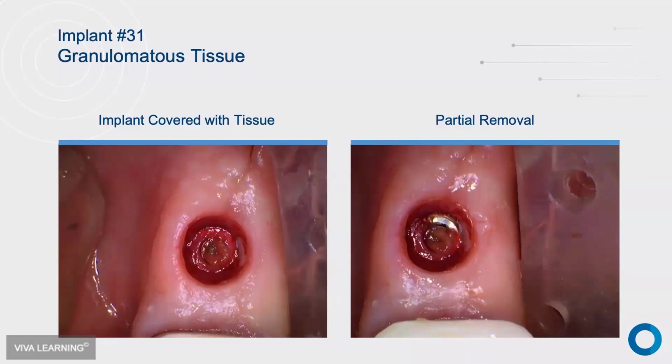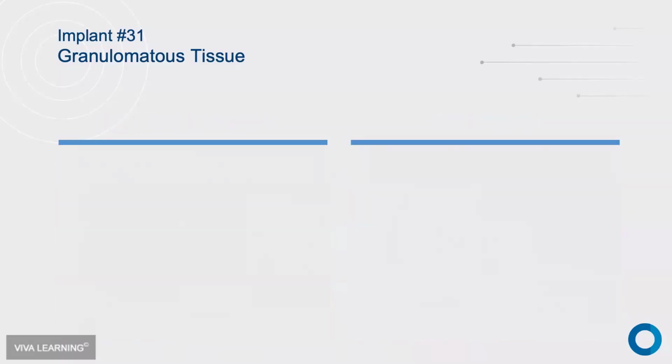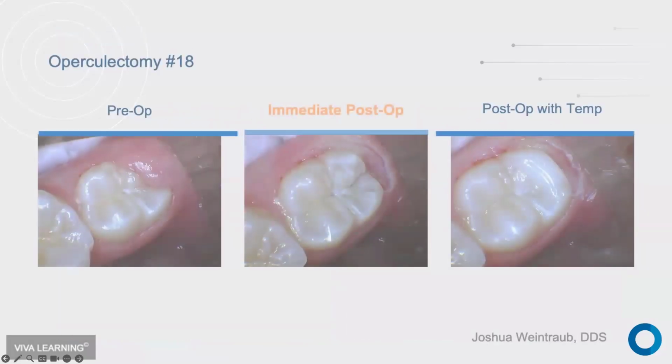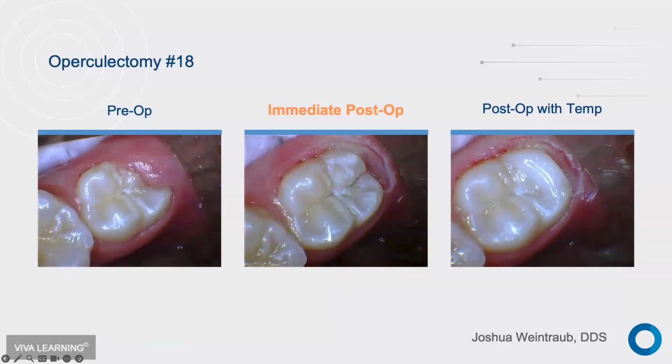Well, this is safe to cut around, right? So as you go through there, if I'm glancing to the side of that metal, I'm not going to heat or arc or spark that implant. I can clean that up all day long. Again, how were we handling this before? We'd be like, oh, shoot, I guess you got to go back to the surgeon, versus you have a tool that can do it. Sculpting back for an operculectomy. Easy, right? You just pointed at it just like some of those other cases I showed you, and it's absolutely going to cut it.